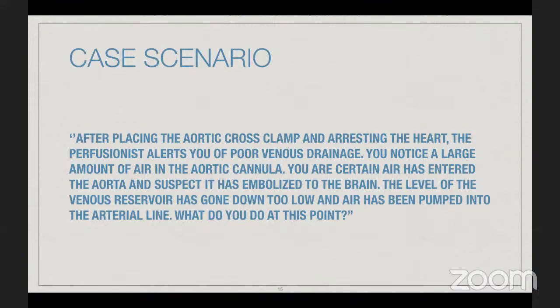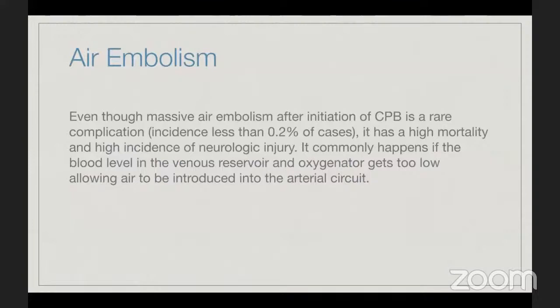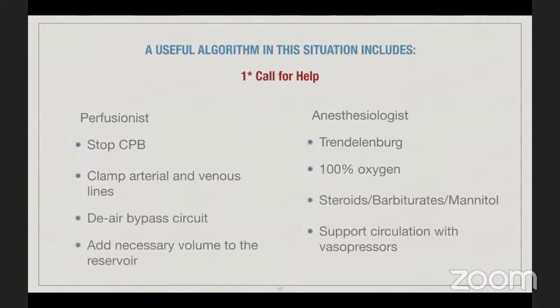Thank you. Okay, so this is a case of air embolism. Even though massive air embolism after initiation of bypass is rare, the incidence is less than 0.2% of the cases. It has a high mortality and high incidence of neurological injury. It commonly happens if the blood level in the venous reservoir and oxygenator has gone too low, allowing air to be introduced into the arterial circuit.